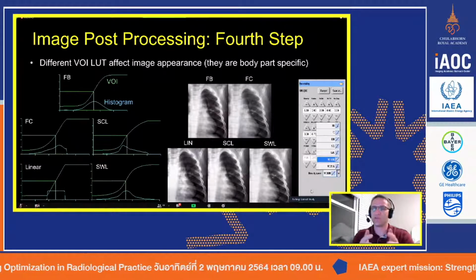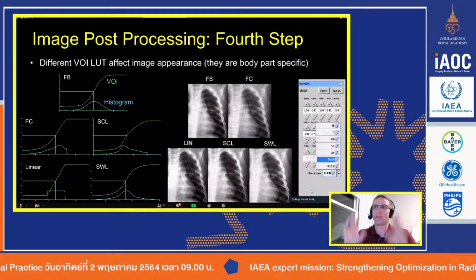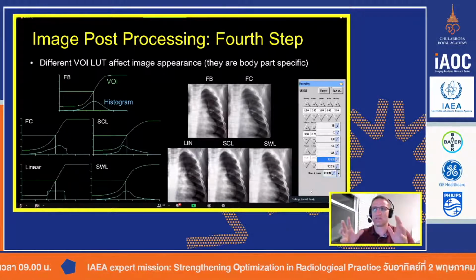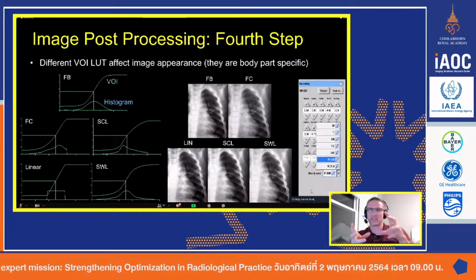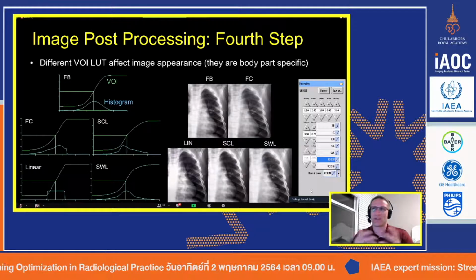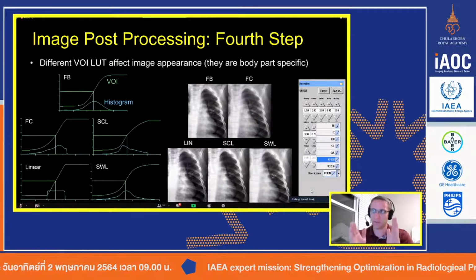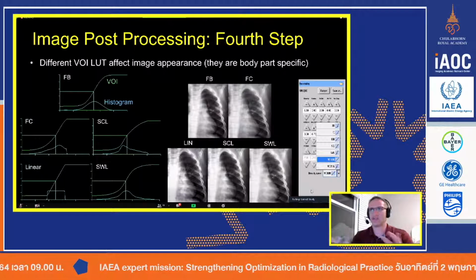If you make two or three looks or views, make sure you send them all, so the radiologist can see them and go, oh, okay, I can see the differences. Because if the technologist keeps twisting it and manipulating it and making it look as pretty as you think and sends it, you may have changed the anatomy, maybe covered some pathology, and the radiologist will never know. But if you send two or three different looks, then the radiologist has the opportunity to see how it's changed.